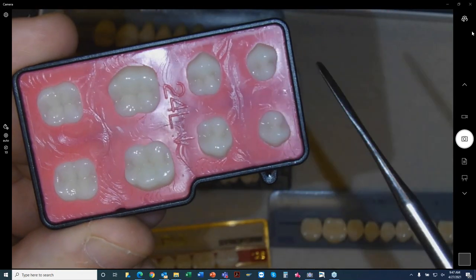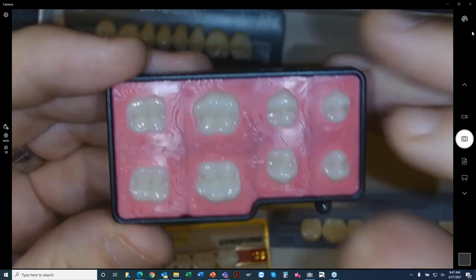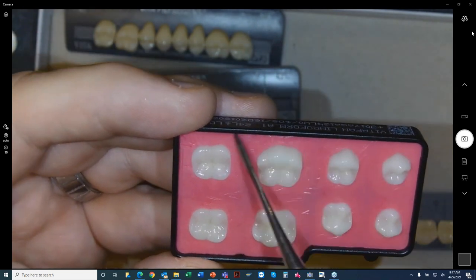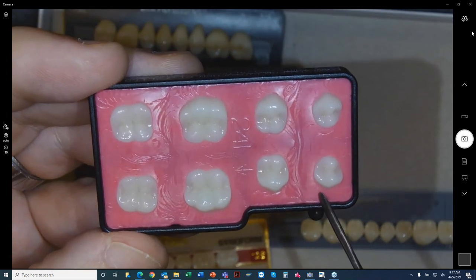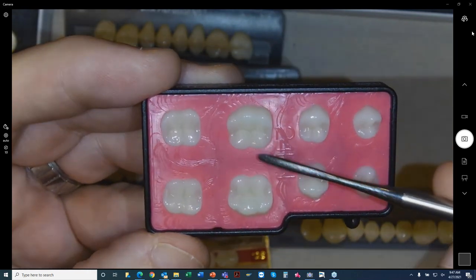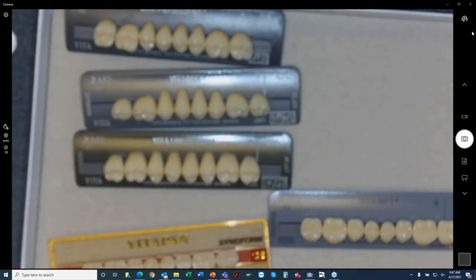This is the MRP, a strong, durable material for long-term use for fixed dentures as well. But as I mentioned earlier, Amann Girrbach and probably others now have denture design software where you can do just an upper or just a lower, in which it will spot mill certain areas, especially if it's going to be against a natural dentition.